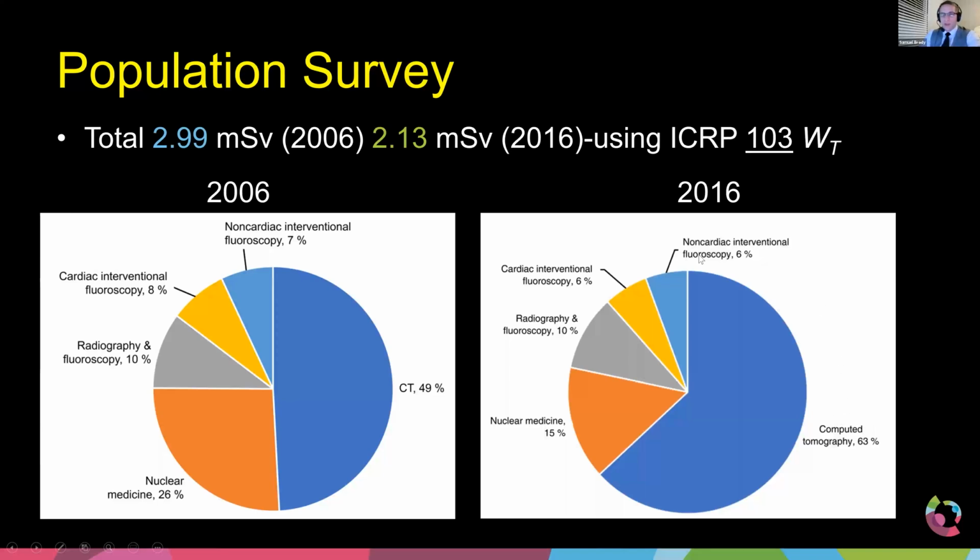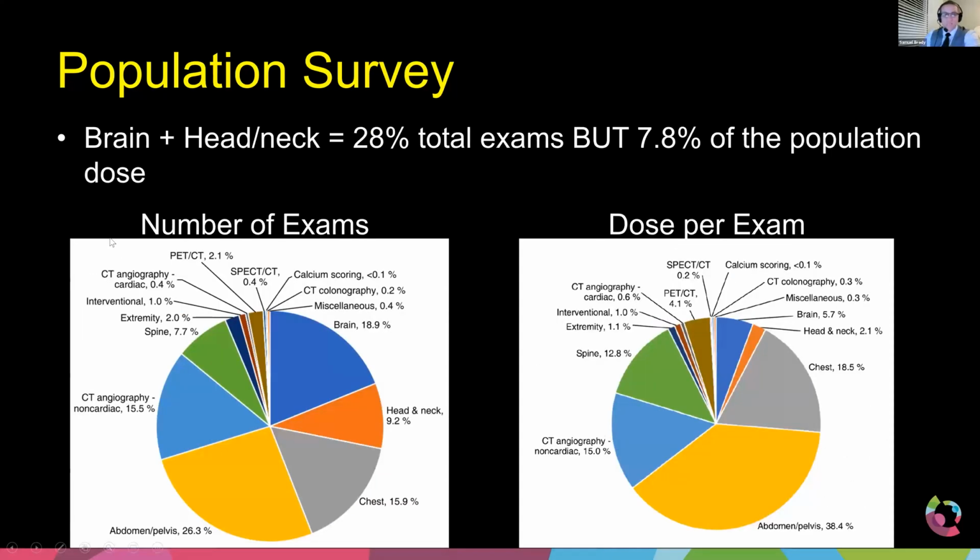And a big part of that is what we're going to talk about today, of all of the positive optimization that we have done, like we've talked about already in the last hour, and we will talk about now. All of those efforts that have been put into place for about a decade have paid a huge dividend, have reduced the overall population dose, even though we're using imaging more. So one would argue we're imaging safer now.